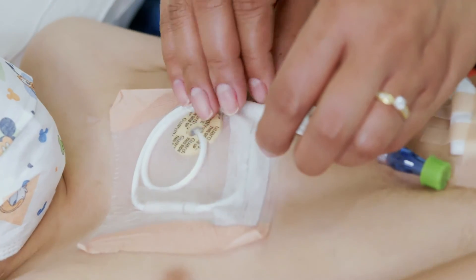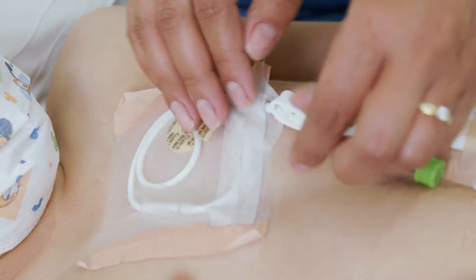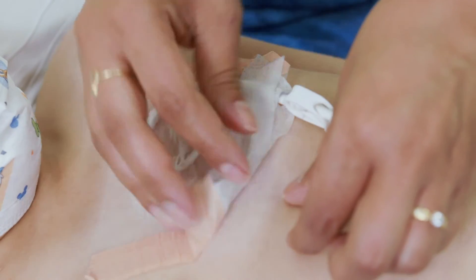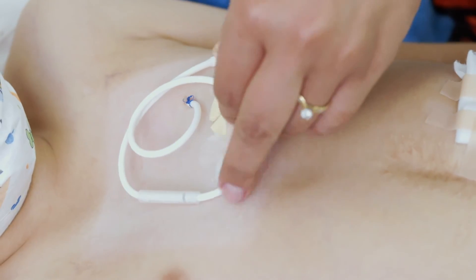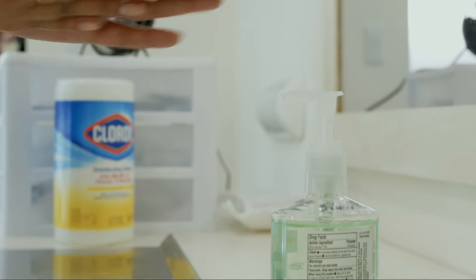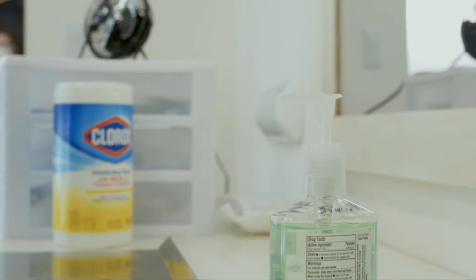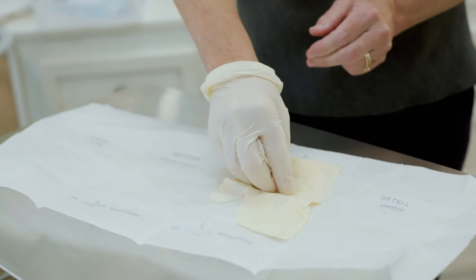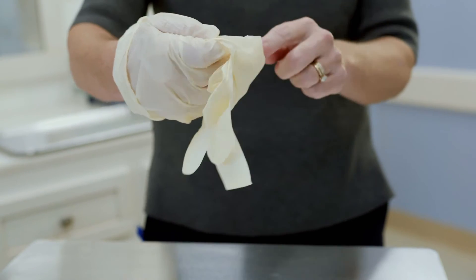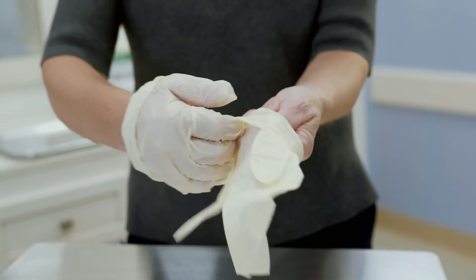Take off the old dressing carefully and drop it into the trash. Make sure not to touch the central line site. Clean your hands again before changing the dressing. Put on the sterile gloves and keep them on the whole time. Make sure you only touch the sterile area — do not touch anything else.